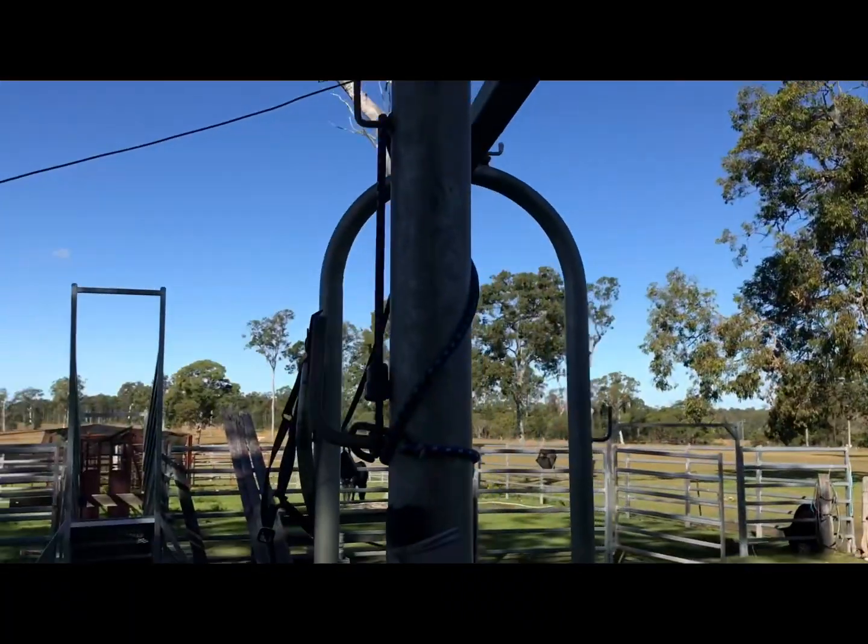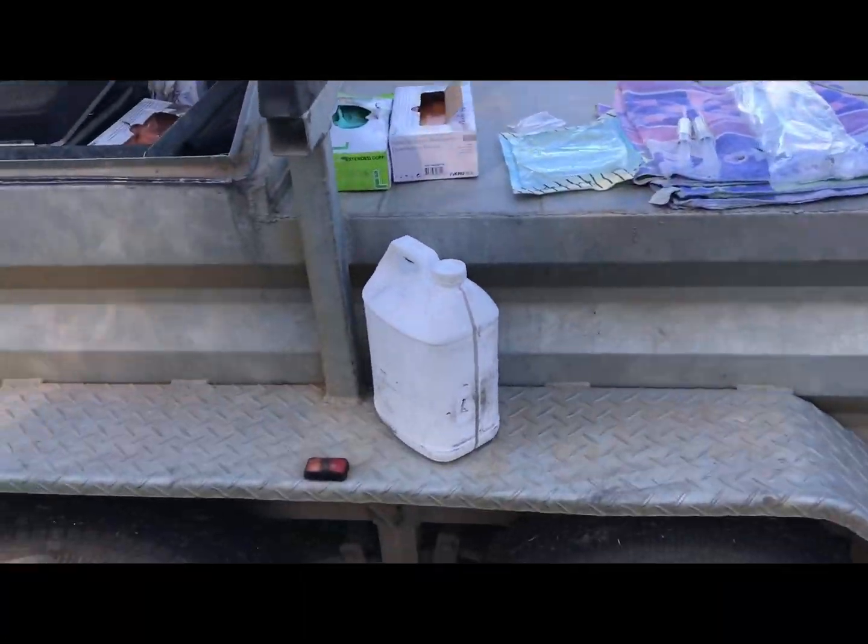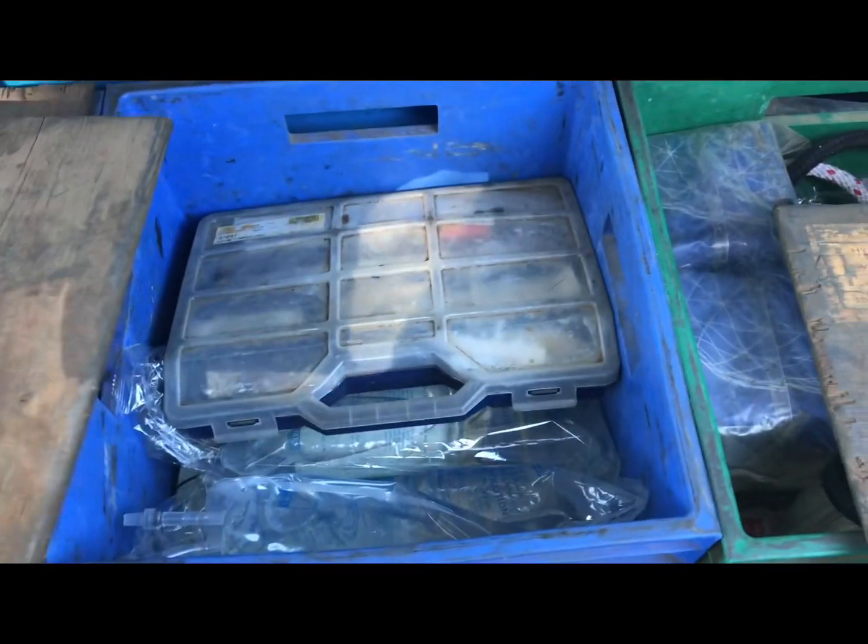We've got hooks to tie their tails up, we've got heaps of bench space going on the other side of the trailer, we've got twitchers, we've got heaps of boxes — surgery box, bandage box, ropes, fluids.